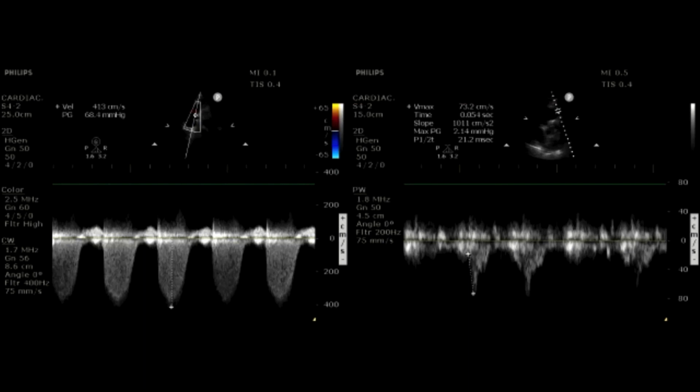For those of you who joined us, thank you for being here. I know it's been a good hour talking about the use of echo for PE. We talked about a lot of other things, at least mentioned them throughout the course of this talk. Other ways of assessing the heart with echo for PE, with TAPSE, with S prime and stuff like that. If you want to know more, we can certainly hit that up on this forum. But the article that I mentioned at the very beginning, this article right here, goes through all of that.